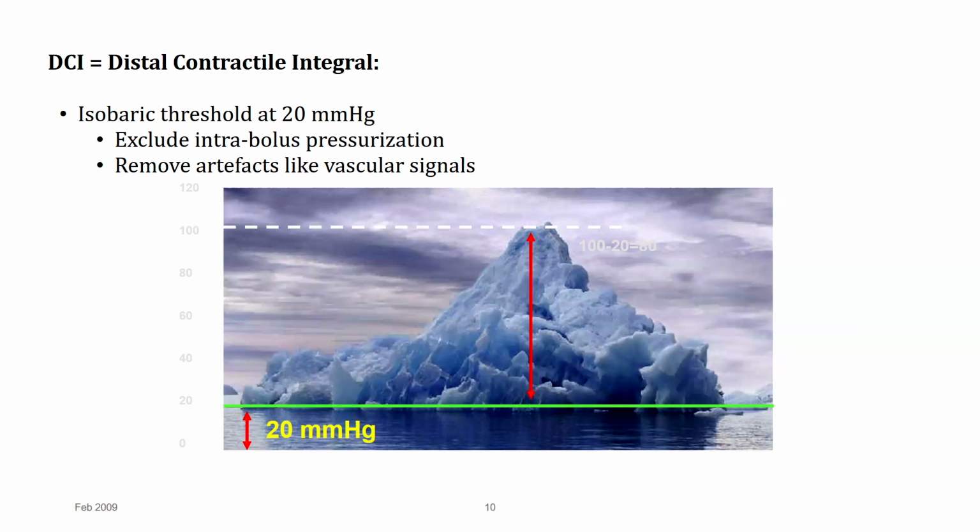It's very important. And we will see later on in the Chicago classification, when we are going to make evaluation for achalasia, especially achalasia type 2, the pressurization should be done considering the isobaric threshold of 30, not 20. When we are going to measure the DCI, we have to measure considering the isobaric threshold of 20, not 30.